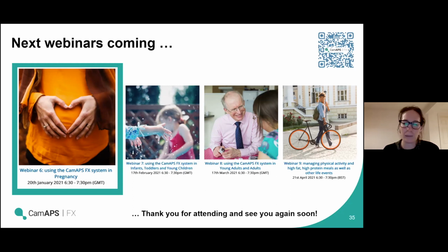Hopefully there aren't too many calibrations, because we wouldn't normally expect calibrations unless there are issues with the sensor. They don't need calibrating. So if it's from a separate glucose meter, that can be paired to Diasend as well. That's not an issue. But I'm not sure why they'd be doing lots of finger stick glucose measurements.